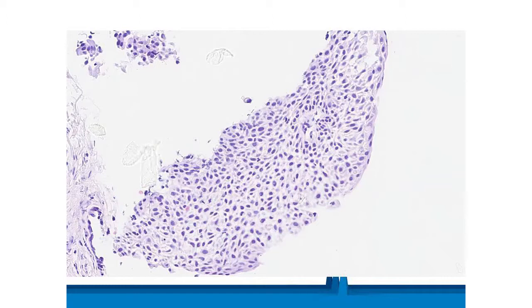And the second area for caution was around dysplasia. Two cases of where dysplasia had been overcalled on digital. This was one, it was called dysplastic bronchial metaplasia on the digital, not on the glass, and we don't think it is truly dysplastic. I think the reason for that is that the nuclei do look quite dark against a very bright background on the digital system and look more dysplastic as a result.